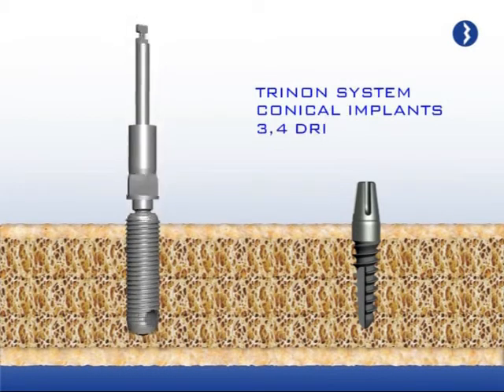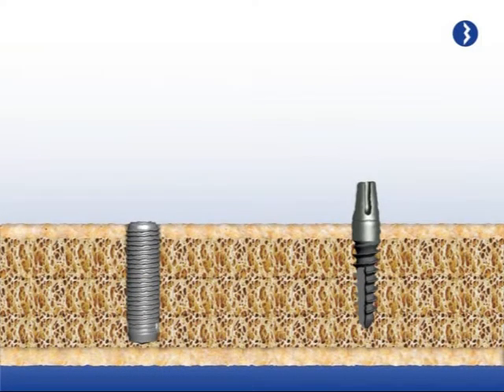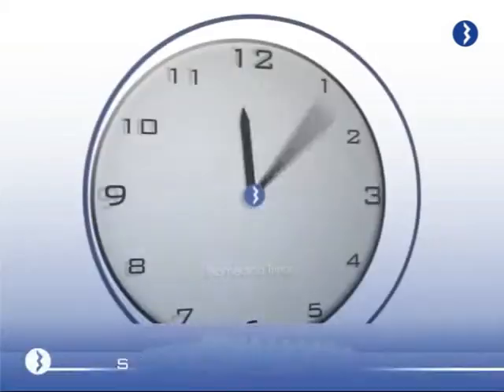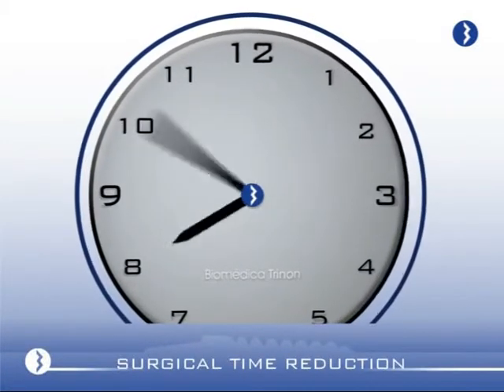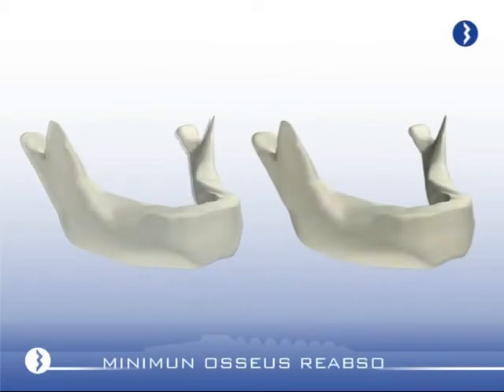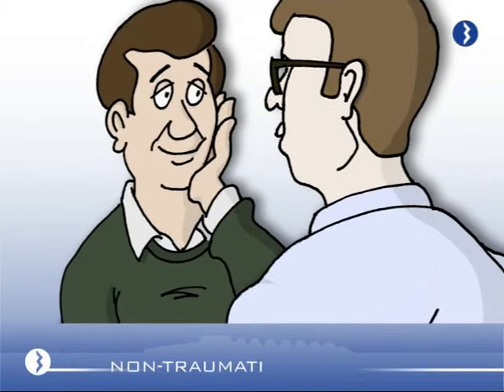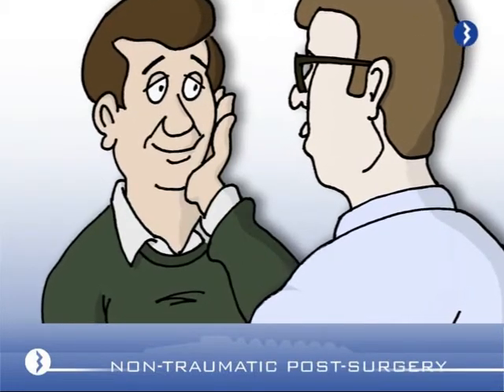The great simplicity of the Q implant drilling systems gives us 3 great advantages. Reduction in surgical time. Minimum osseous reabsorption. Post-operation is untraumatic for the patient.